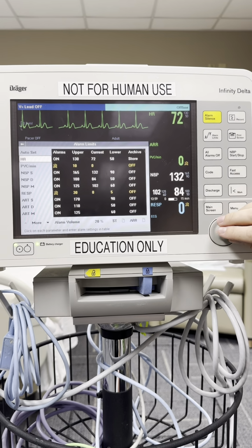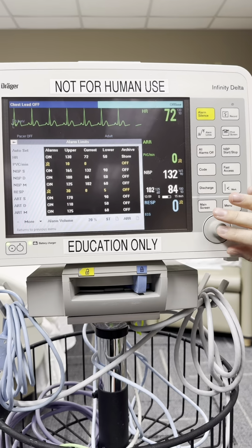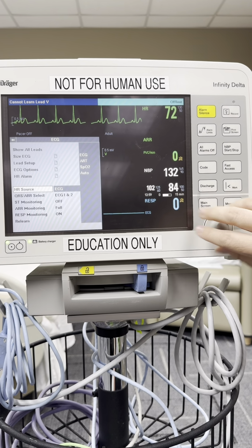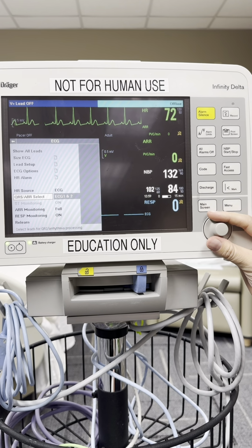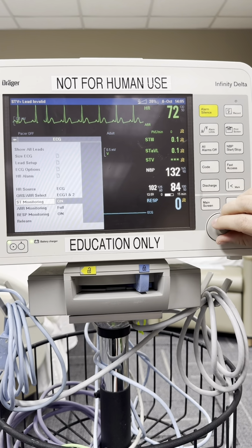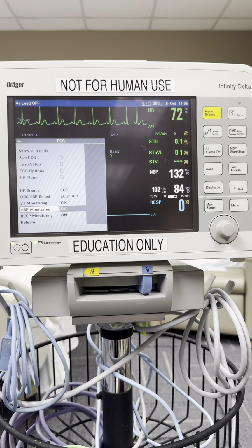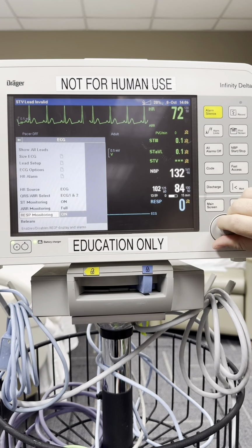Heart rate alarm. This is how you change all your settings, if you need to lower it or increase it. And then down here, you can add on ST monitoring if you need that extra monitoring. It'll pop up right here. There's arrhythmia monitoring. That should be on full at all times. That's gonna monitor for all arrhythmias. And then your respiratory monitoring as well.